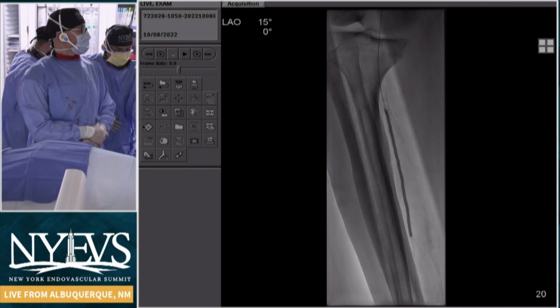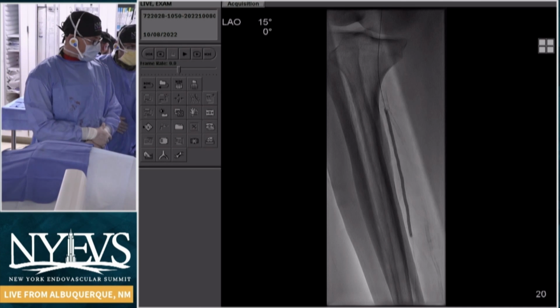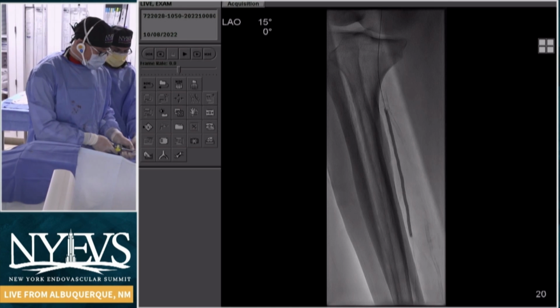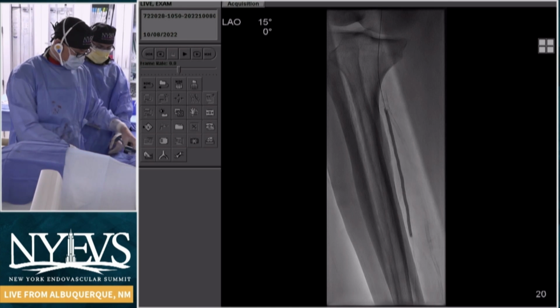Hi, Steve. How's it going? So we're just finishing up our angioplasty of the peroneal here, and we're going to take a picture here. Okay.